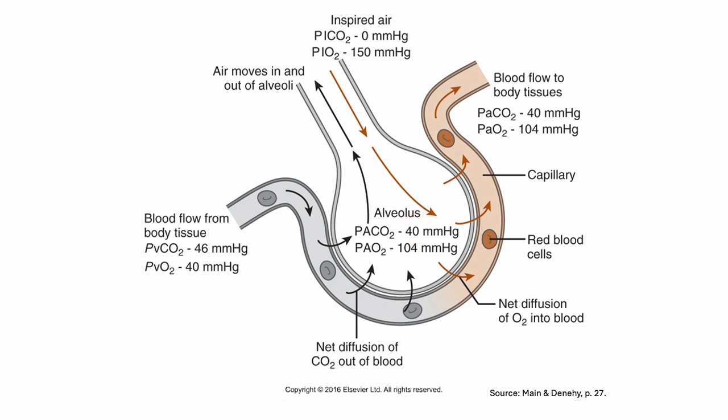But because by the time this travels all the way to the airway, there might be some losses for whatever reason, that's the reason why we say that EtCO2 is normally lower than what is actually in the bloodstream, in the small a, the arterial blood.